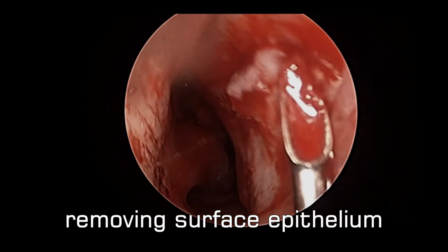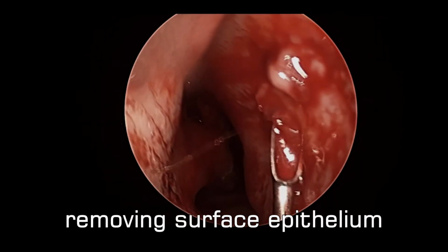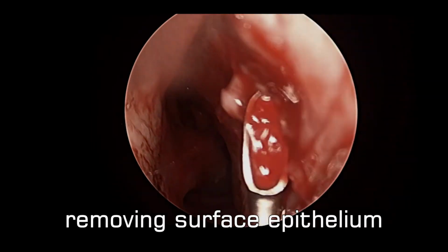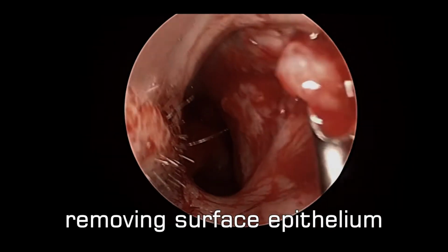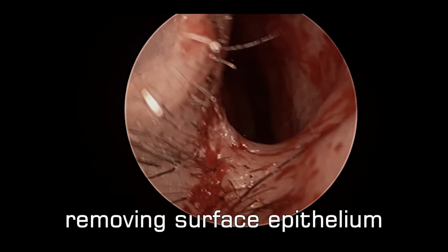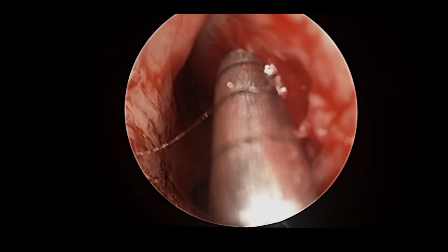tissue. As the patient has failed for this area to heal with so many topical agents, etc., it was time to resort to a more powerful means to potentially get this healed, which involved scraping, and we'll resurface the area.